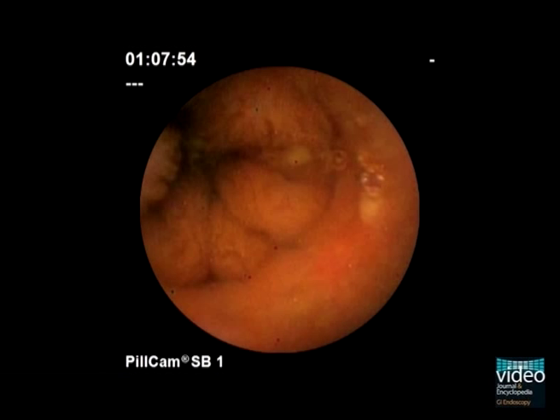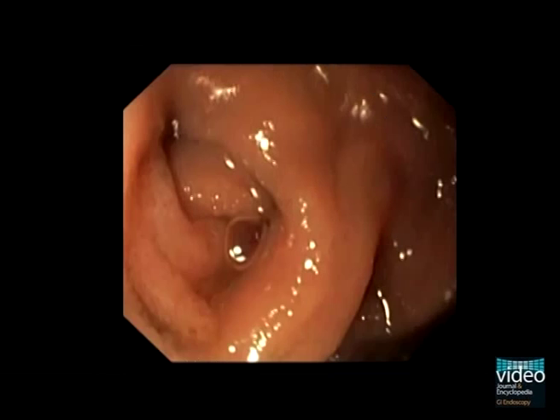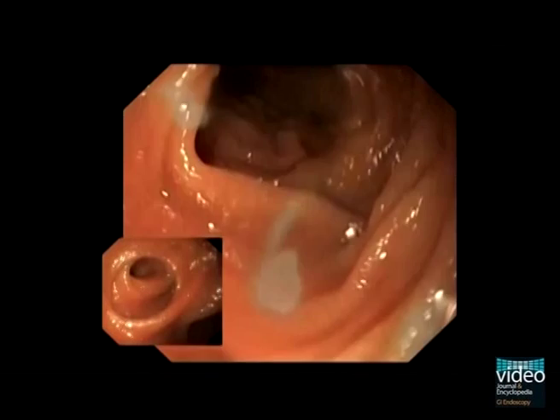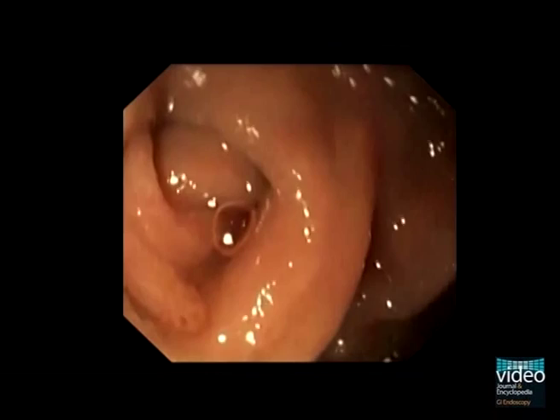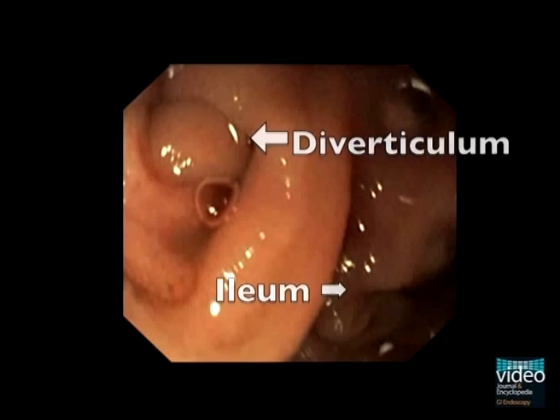In this 21-year-old patient, capsule endoscopy had shown active bleeding in the distal ileum. Consecutive retrograde single balloon enteroscopy demonstrated a Meckel's diverticulum. When partially intubating the long diverticulum with the endoscope, an ulcer was seen. Gastric mucosa was not detected endoscopically, although it was diagnosed in the resected specimen.